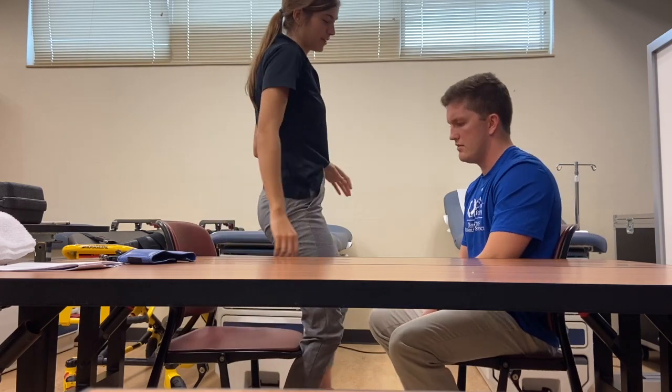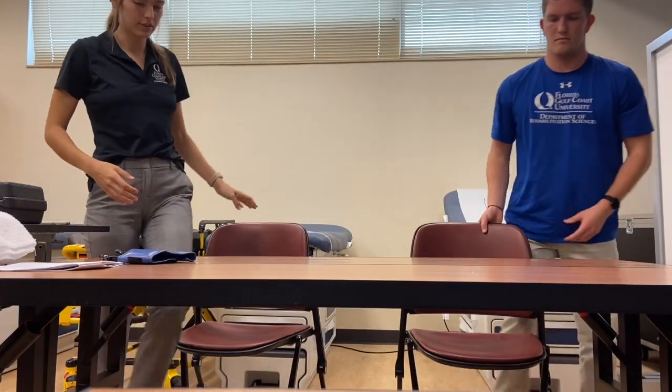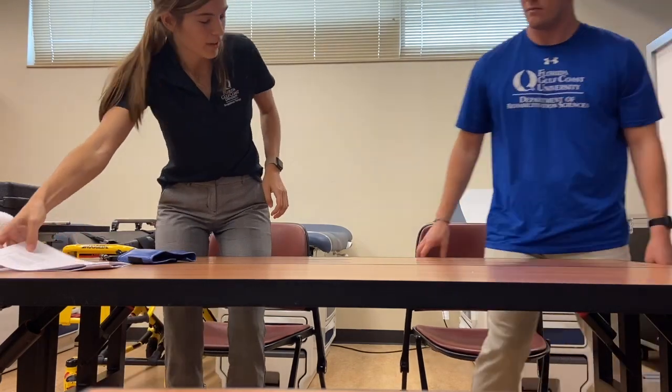For this next one, we're going to go ahead and change our chair position. So if you could go ahead and stand up. And now we're going to go on to the next task. You're going to place your hand on the table so that the heel of your hand is fully on the table. Your hand does not need to be flat and do this as quickly as you can. Do you have any questions? Just the one hand? Yes. Ready, set, go.